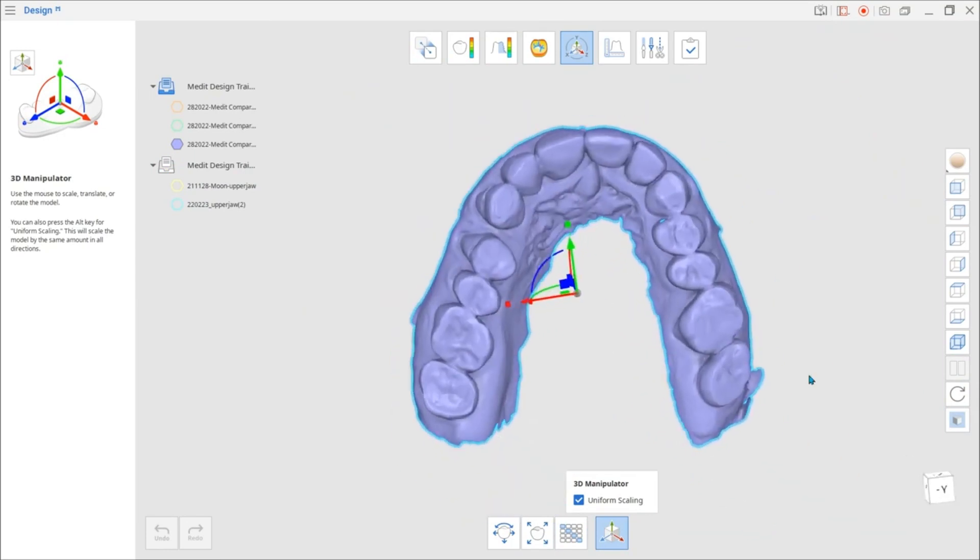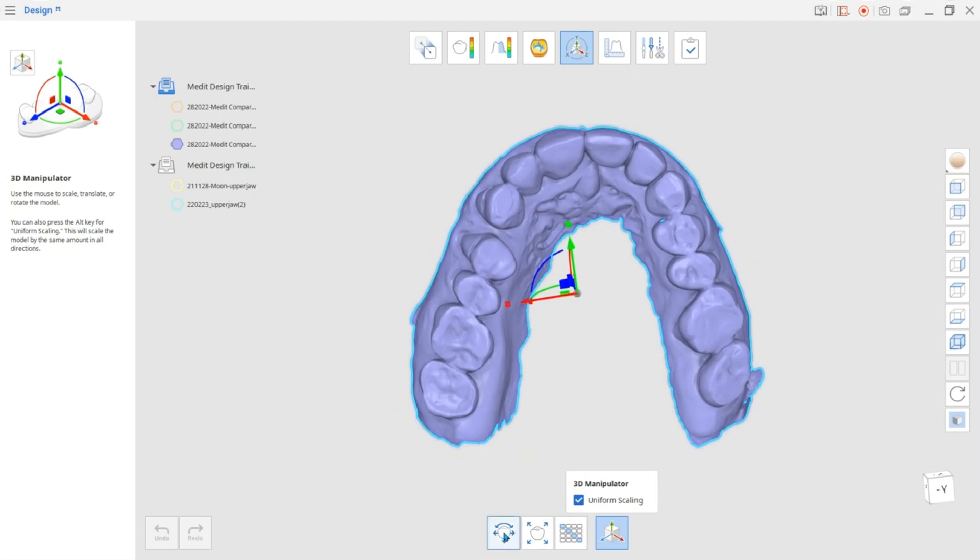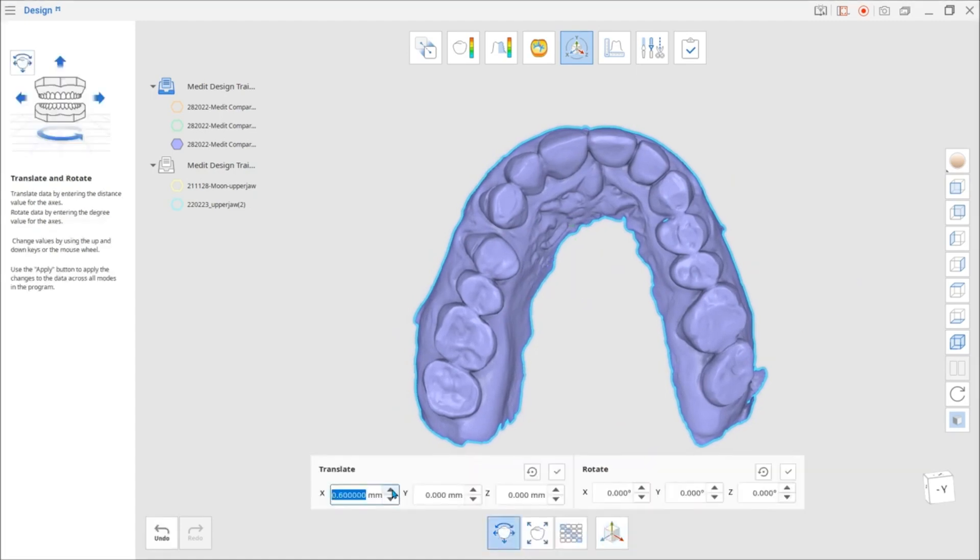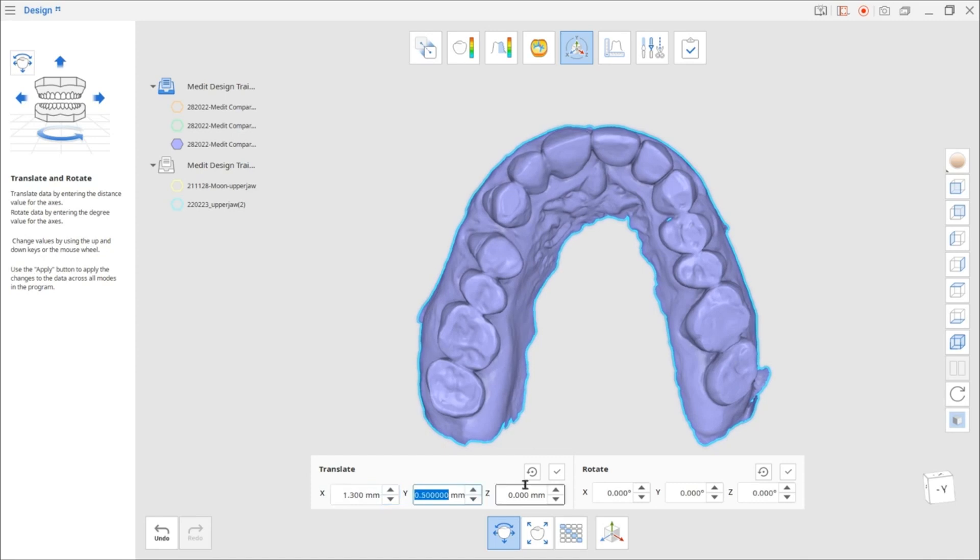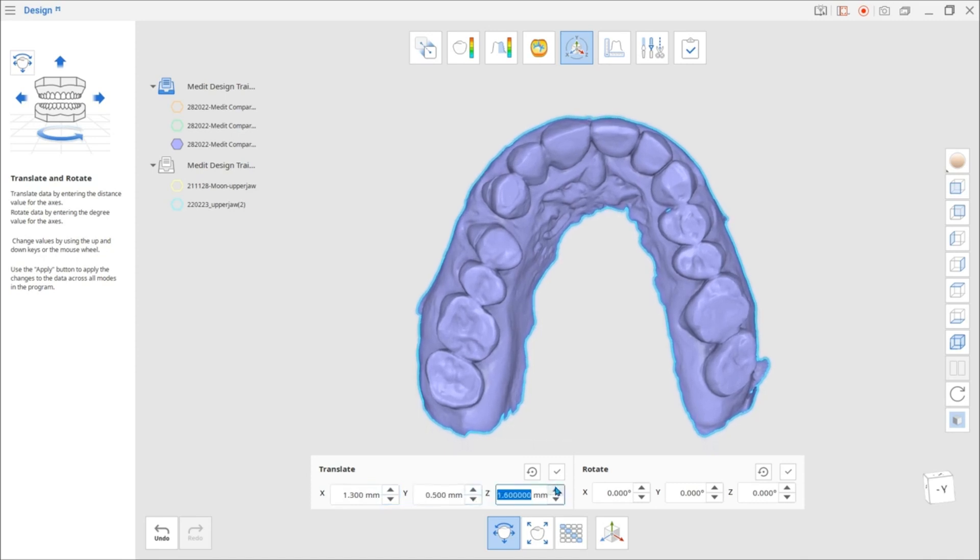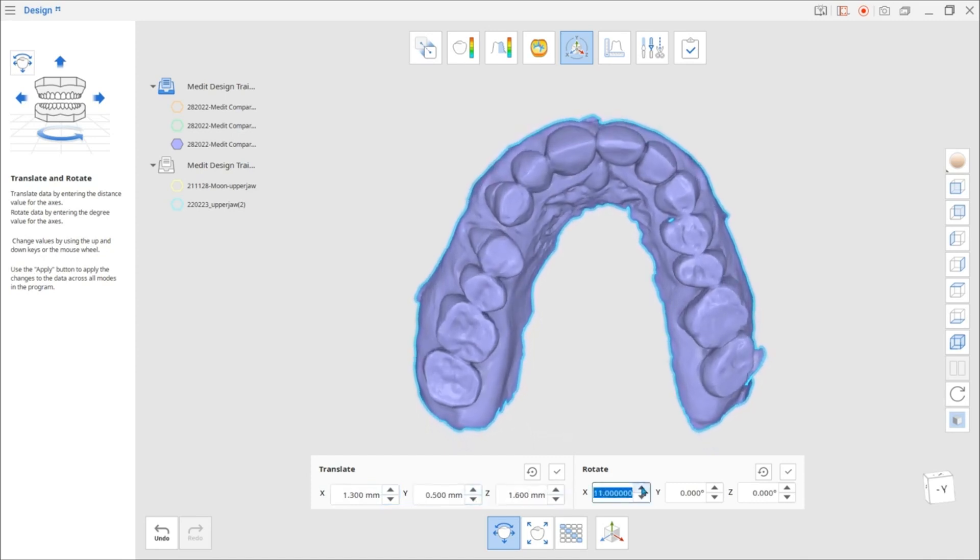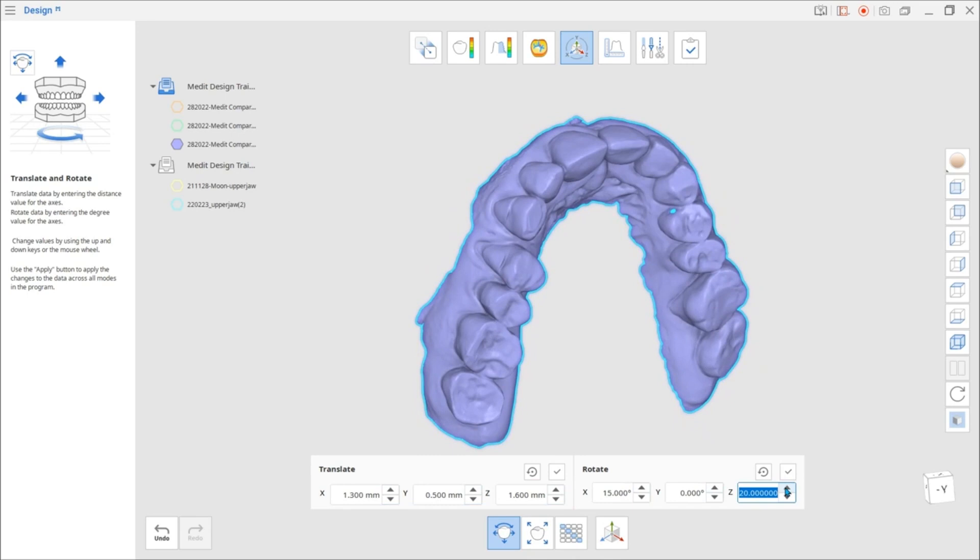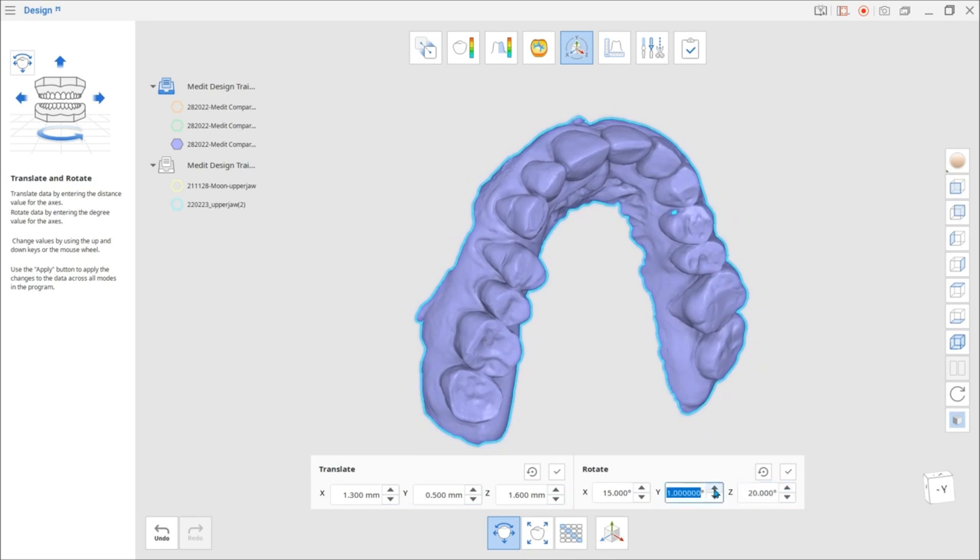Let's go over the transformation tools listed at the bottom. Click the first icon to translate or rotate data by entering the desired value for the X, Y, or Z axes. Use the Apply button to save changes.